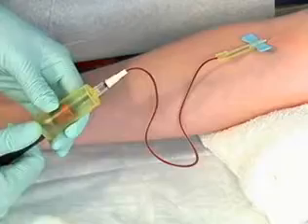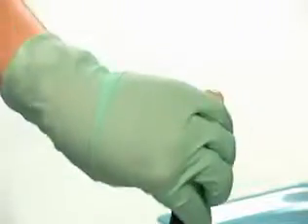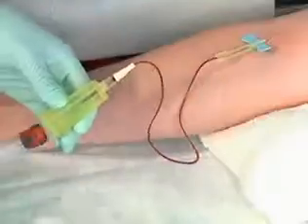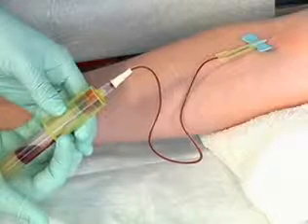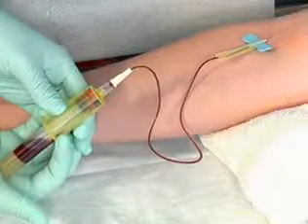Pull the tube off the posterior needle. If the tube contains a clot activator, gently invert the tube back and forth 5 times before laying it down. Carefully insert the second serum separator tube into the plastic holder and push it forward to the end of the holder. Allow the tube to fill to the exhaustion of the vacuum.